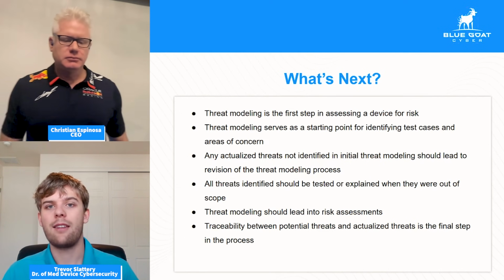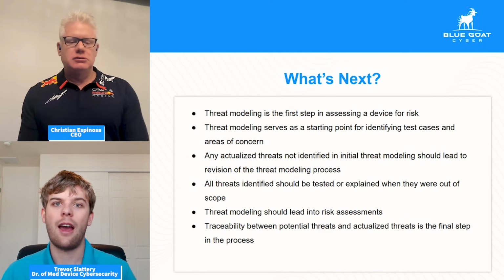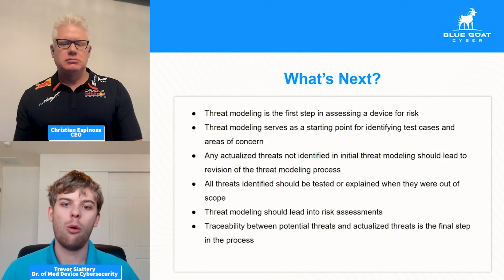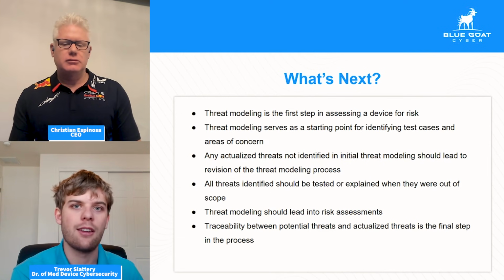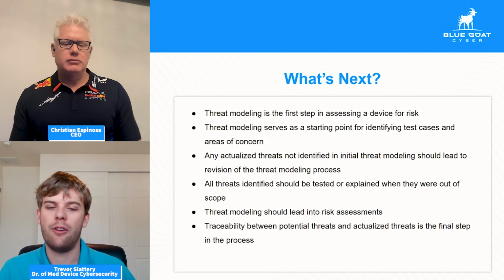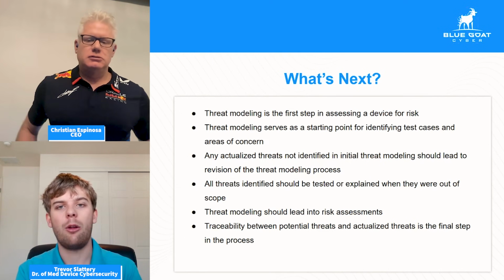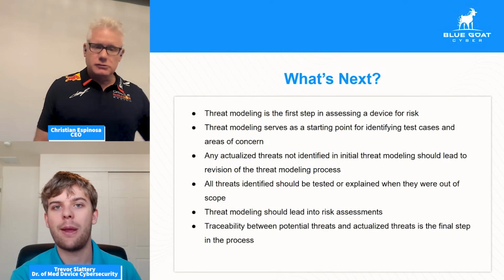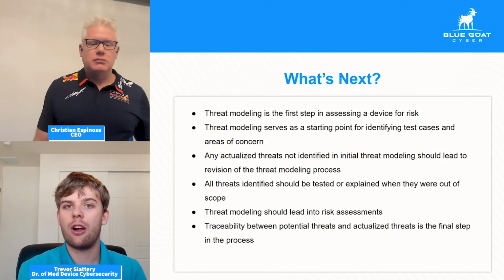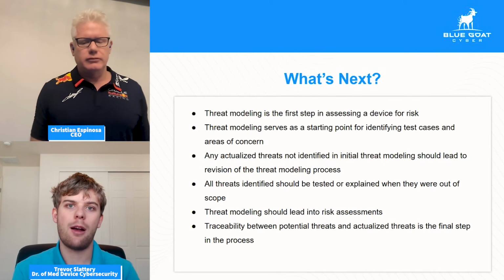Now, for the 10 threats that we are able to realize, we're able to perform these exploits and identify a vulnerability in the system. What is the impact? It could be fairly insignificant, such as just a banner on a web server that is showing the version of Nginx that's used. As long as that's a secure version of Nginx, it's not really a ton of helpful information. While, of course, that is still not best practice to have information like that disclosed, from a patient harm perspective, from a patient data safety perspective, it's not going to be top of the problem.